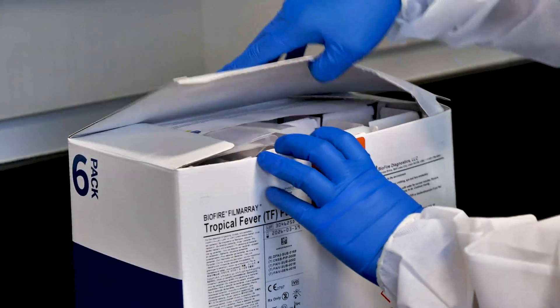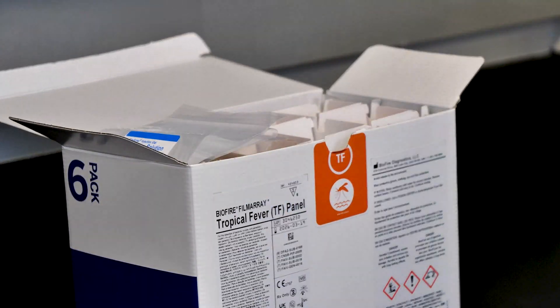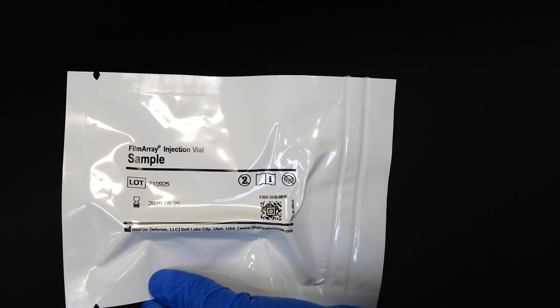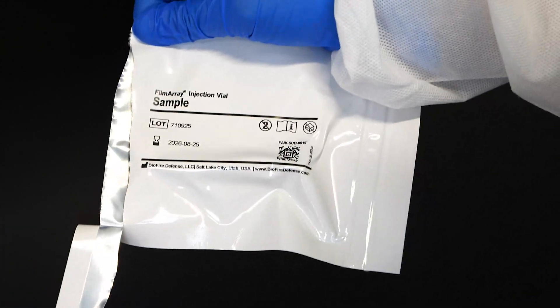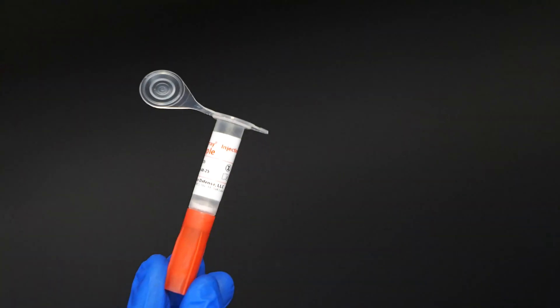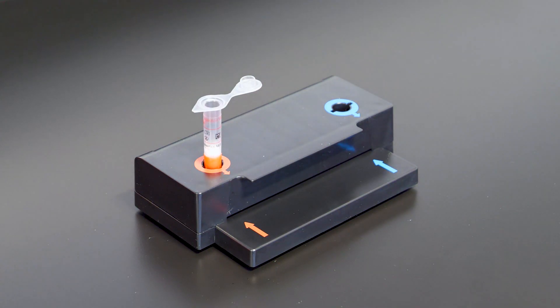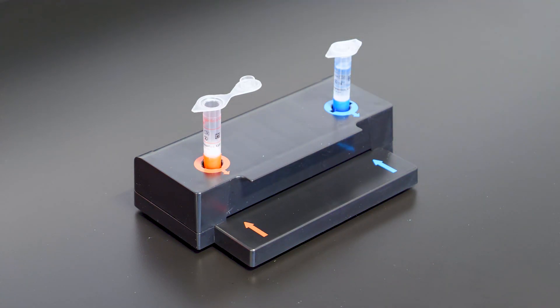Use clean gloves when removing reagents from bulk packaging bags, and reseal bulk packaging bags when not in use. The sample injection vials come individually packaged in a foil pouch. Remove the sample injection vial by tearing or cutting the notched packaging. Place a red-capped sample injection vial into the red well of the pouch loading station, taking care not to touch the inside cover. Place a blue-capped hydration injection vial into the blue well of the pouch loading station.